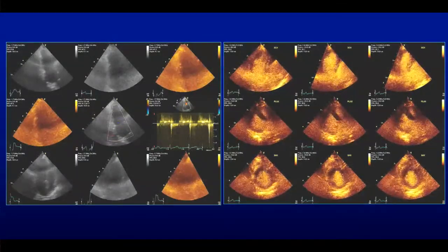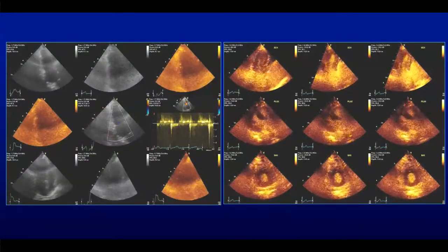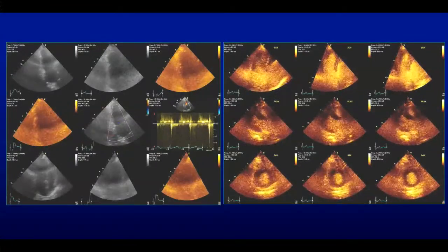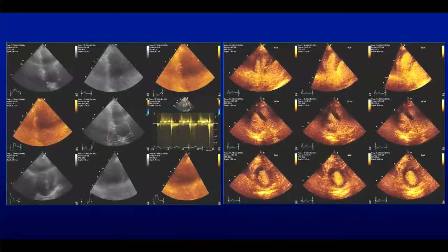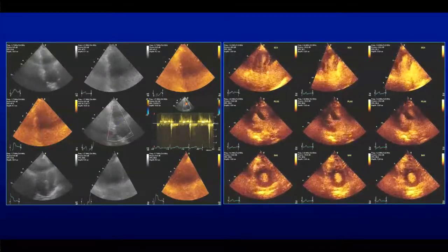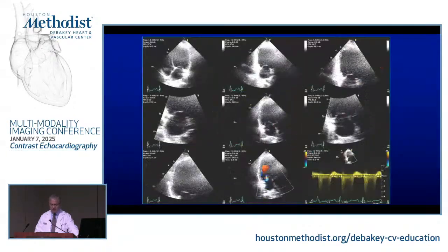Now remember one thing, that this interpretation is talking about ventricular size and function, global, regional. We're not talking about visualization of valvular heart disease, right? At times the right ventricle may or may not be well visualized, but actually you will hide valvular heart disease abnormalities if you're going to use contrast, because the ultrasound beam will be as reflective, right? So it is usually for ventricular function.